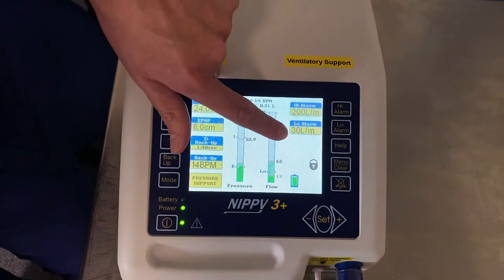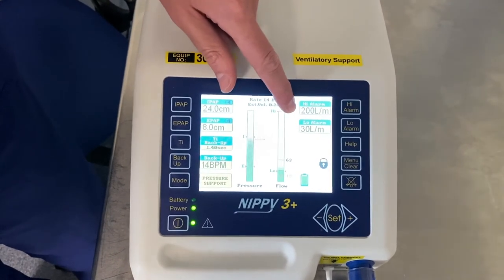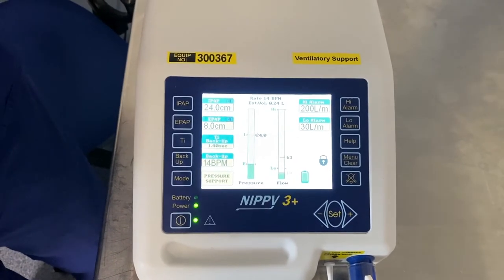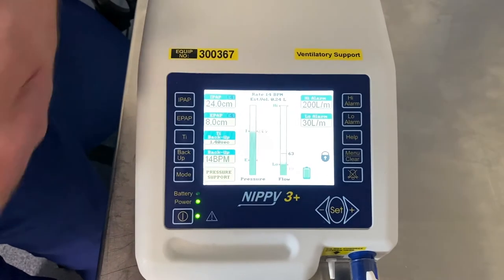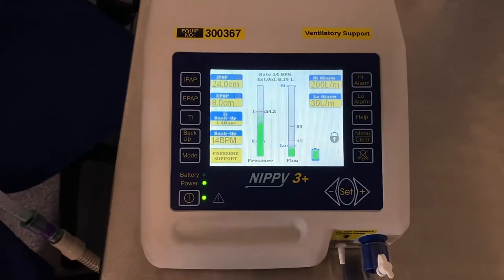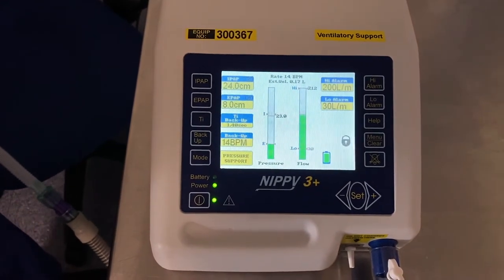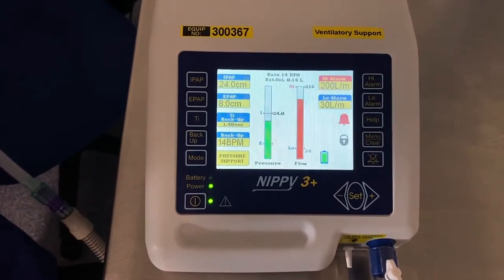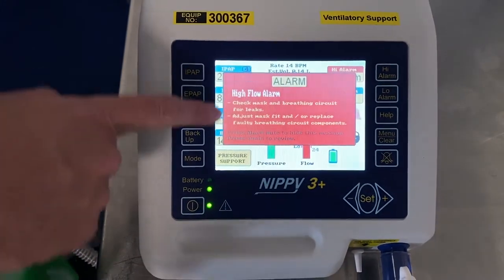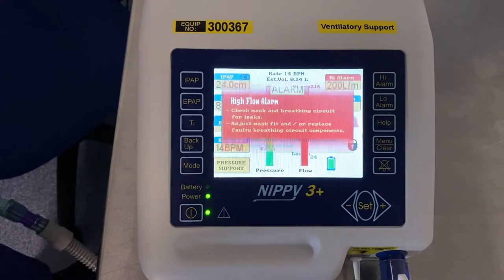We've got sections here which say high alarm and low alarm. If the machine alarms for a high alarm, it means there is a problem with a disconnection from the ventilator — that might be that your mask is leaking, or that the tubing has become disconnected from your mask or from the ventilator itself. The ventilator alarms and tells you there's a high flow alarm, instructing you to check the mask and breathing circuit for leaks, adjust your mask fit, or replace faulty breathing circuit components.